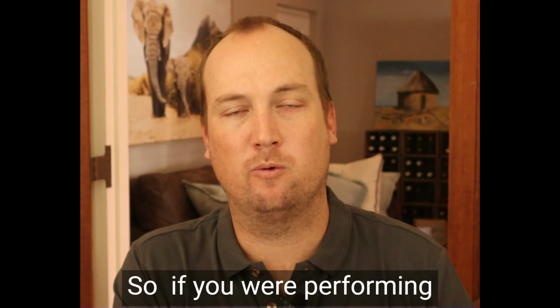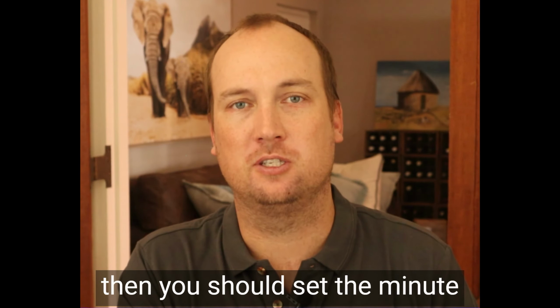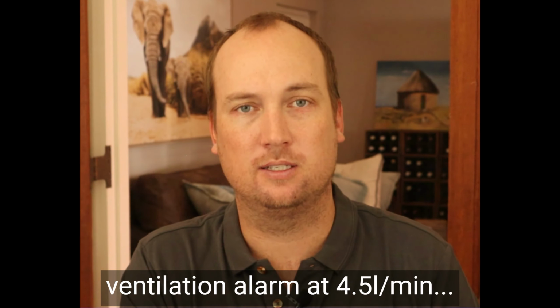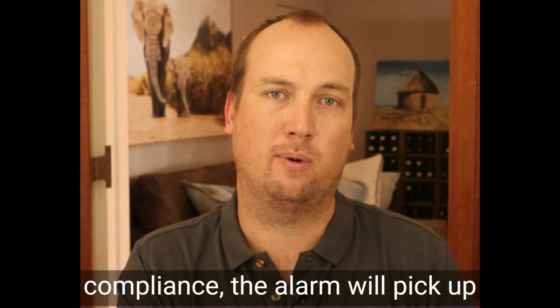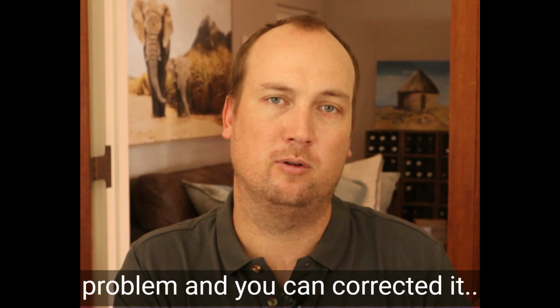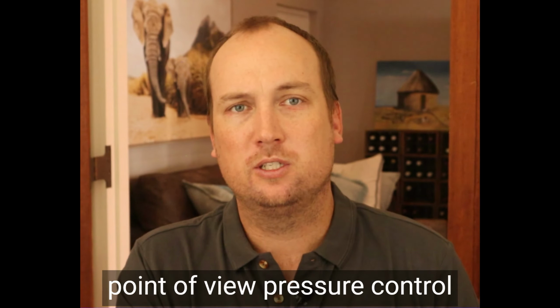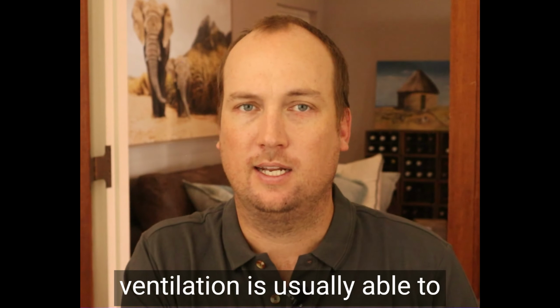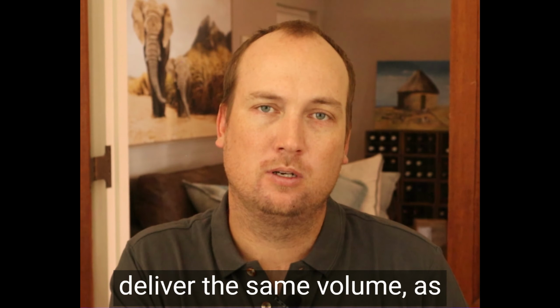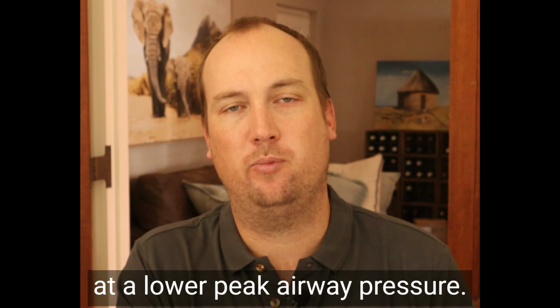So if you were performing pressure-controlled ventilation during my anesthetic, perhaps then you should set the minute ventilation alarm at 4.5 liters a minute. Then if there is a change in compliance, the alarm will pick up that hypoventilation early in the problem and you can correct it. From a physics or physiology point of view, pressure-controlled ventilation is usually able to deliver the same volume as volume-controlled ventilation, but at a lower peak airway pressure.